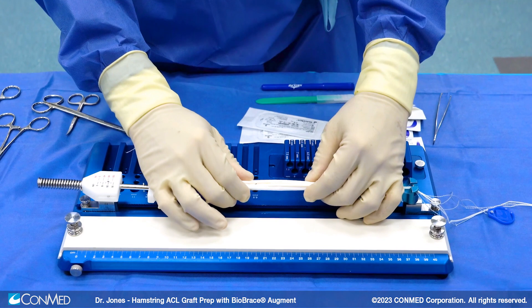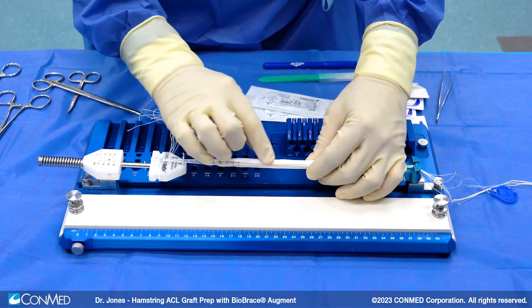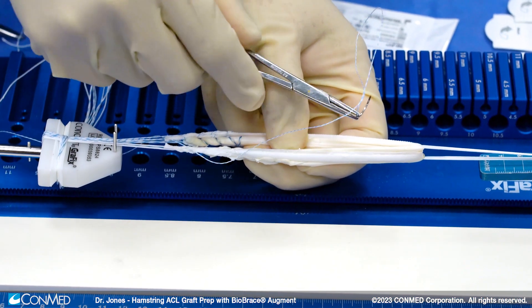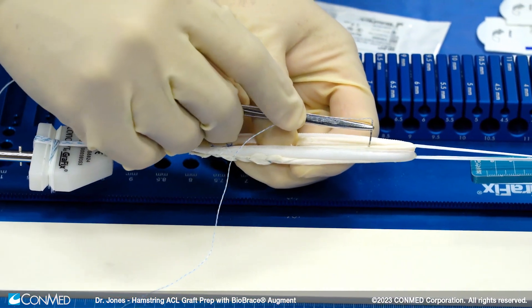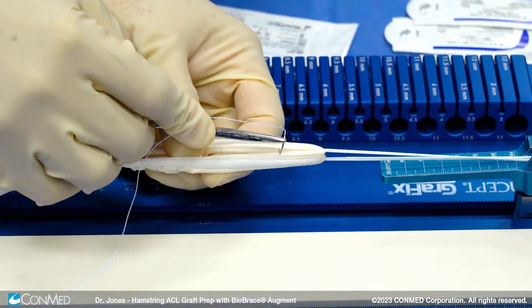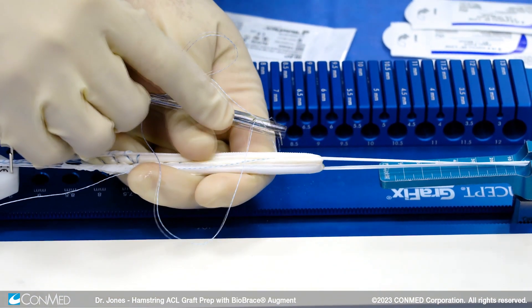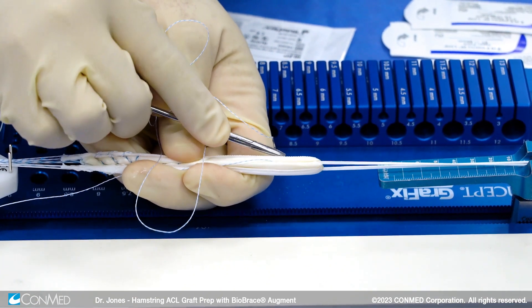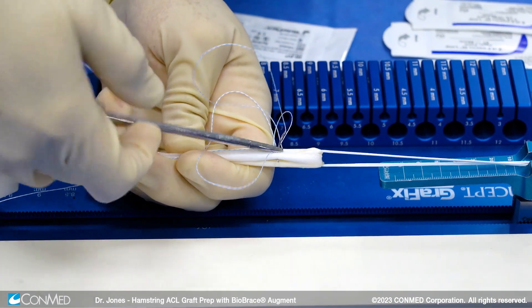The biobrace, as you see, is on the external side of the allograft. This will be exposed to the patient's healing potential, the bone tunnel, and allow for cooperation and use of the unique biologic capabilities of the biobrace. So we have our four limbs: allograft, biobrace, allograft, biobrace. We want to go in between the limbs of tissue, come towards myself — this will invert the knot in the center between the grafts — then come across all four limbs, going through one, two, three, four limbs on the entire construct to grab all four limbs.